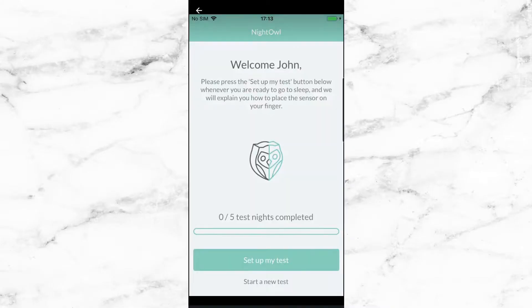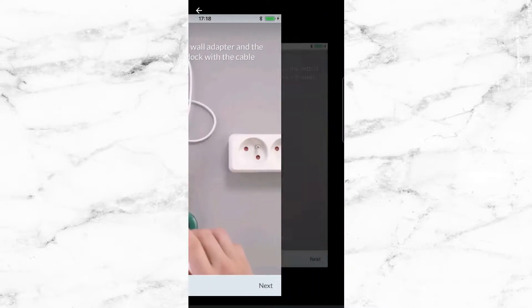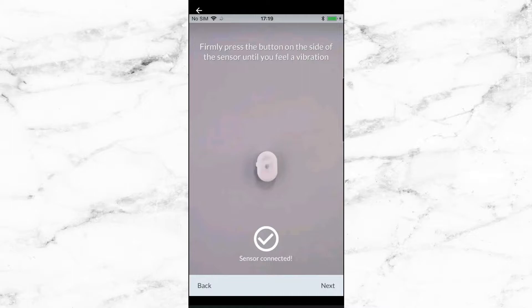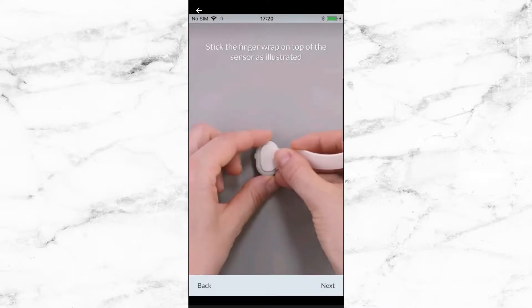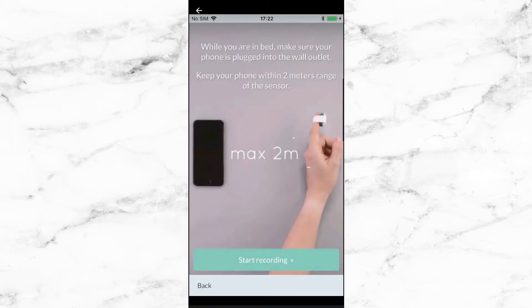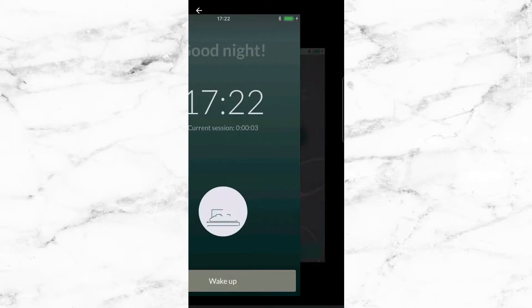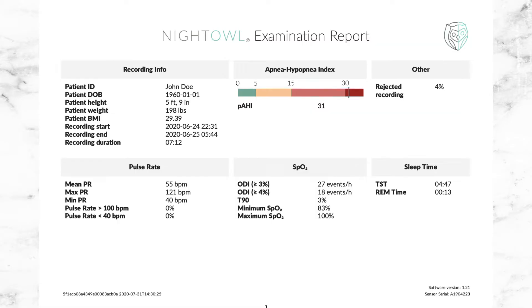So today we are going to be going over the Night Owl. The Night Owl is the future of sleep apnea testing. This little device right here can track your AHI, which is the amount of times that your body naturally stops breathing while you're asleep. It can also track a patient's REM cycles, their SpO2 levels, and a person's heart rate. This is also the first diagnostic device that will be able to record up to seven nights of sleep.